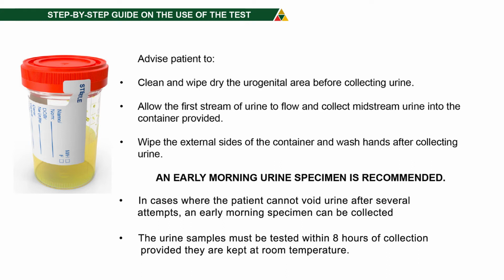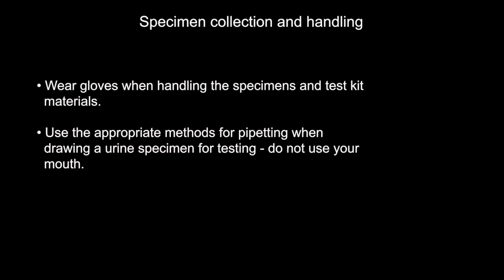Treat all urine specimens and materials contaminated with urine as potentially infectious and follow basic universal precautions. 1. Wear gloves when handling the specimen and test kit material. 2. Use appropriate methods for pipetting when drawing the urine specimen for testing. Do not use your mouth.